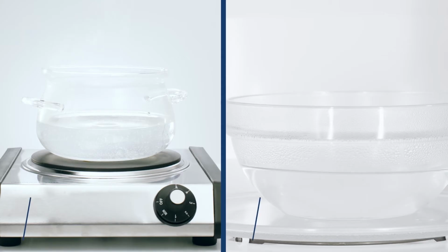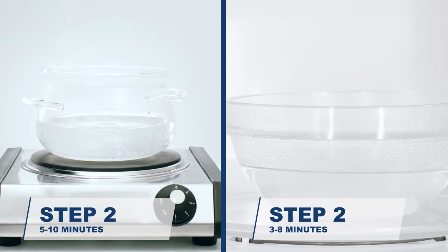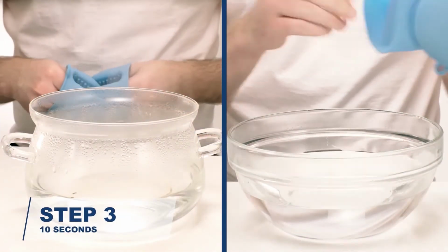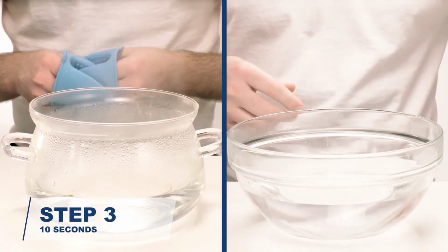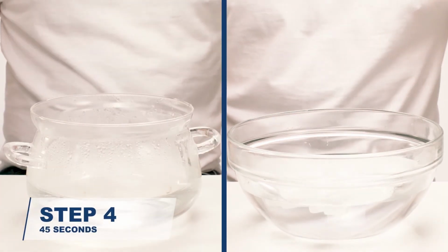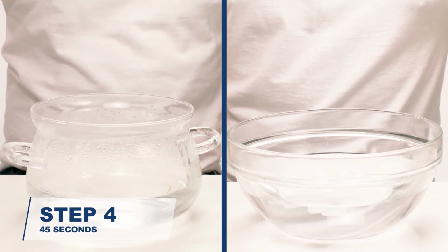on the screen. Using a pot on a stove or microwavable bowl in a microwave, heat at least 1.5 inches of water. Make sure to achieve a rolling boil. Carefully remove your pot or bowl from the heat and place safely on a flat surface. Let rest for 10 seconds. Place the guard and forming tray face down in the hot water for 45 seconds.